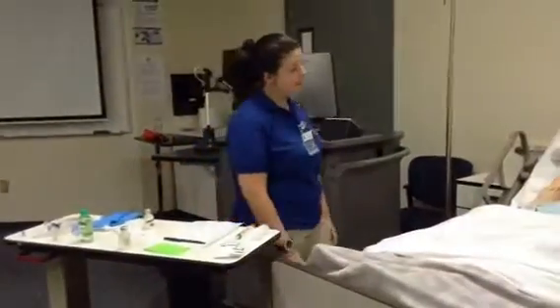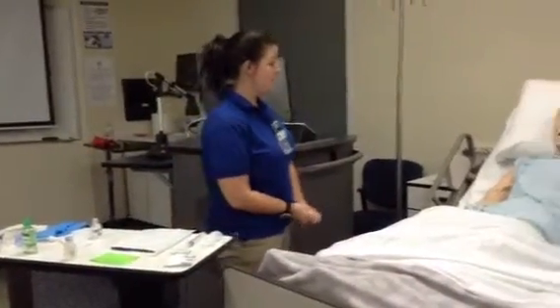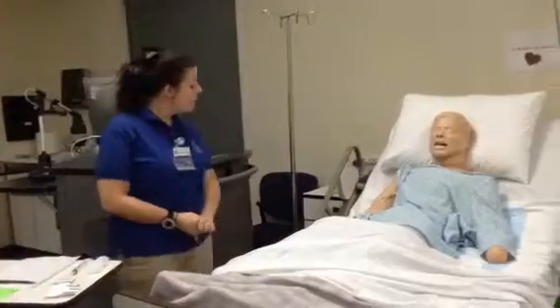I'm in Section 2 and I'm doing my primary IV medication administration. First thing I would do is walk in the room. Hi, how are you doing? My name is Kalen. I'm going to be your nurse today. Could you say with me your name and your date of birth?